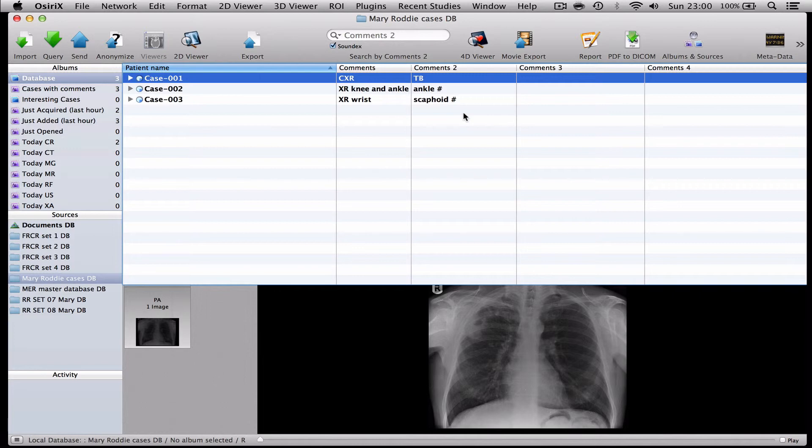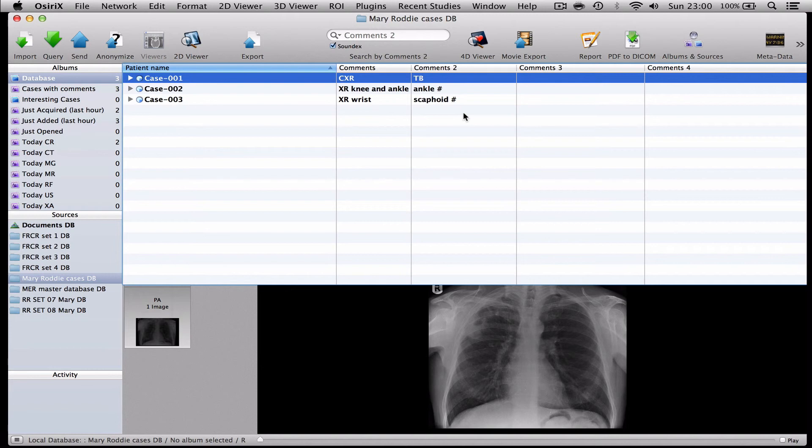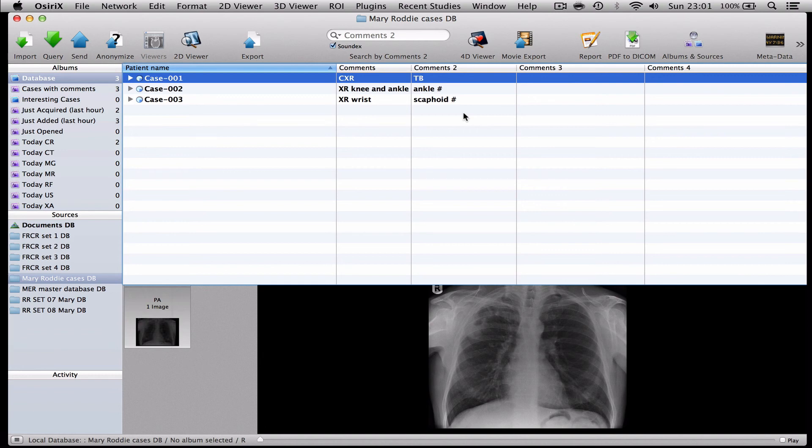So just to summarise, what I've explained today is how to take a set of cases to share with a colleague, to anonymise them into new case numbers and to label them with the diagnosis. And then to make a new database folder which you can copy these cases into and then send using something like Dropbox to share the cases nice and easily. I hope you found that was helpful. Very best wishes from London.